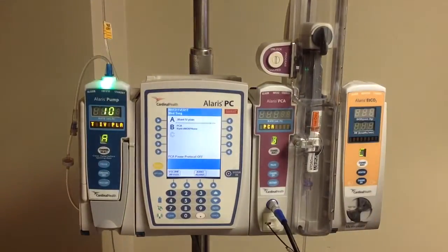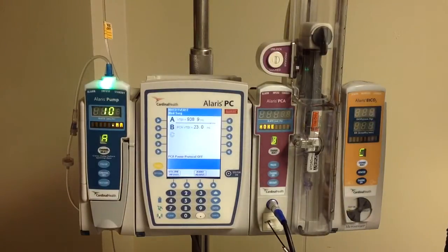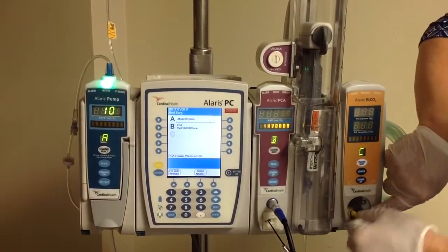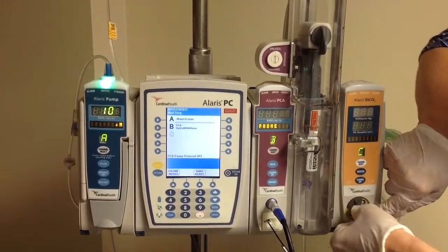Now moving on to one last part about our end-tidal CO2 monitor. We're just going to start by connecting that to our end-tidal CO2 tubing.